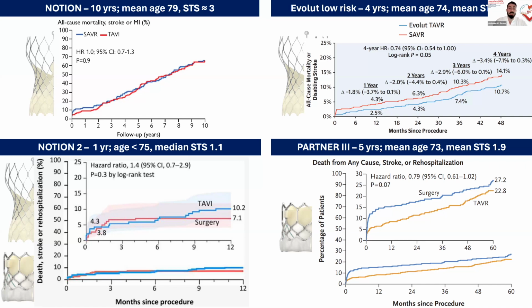And in the remote future, if he requires another THV, we will probably try to perform another SAPIEN, and then maybe again after 30 years, maybe an Evolut.